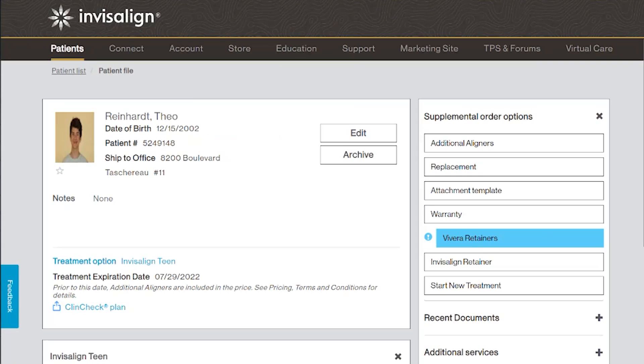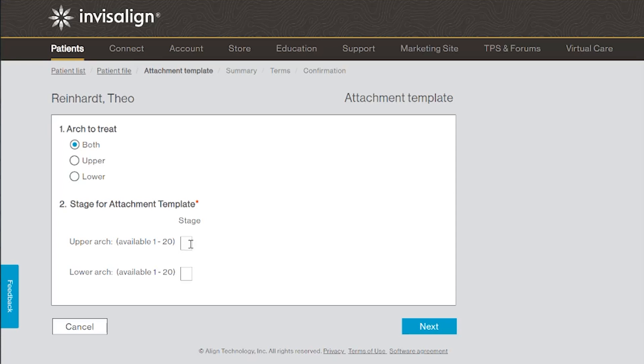That is absolutely the best case if an attachment gets lost — that your patient noticed it at home and calls you telling you which aligner number they're wearing. Then you just go on your doctor's site, click on 'new attachment template,' enter the aligner number, and you receive a perfectly fitting attachment template. It takes about a week to receive, but it doesn't cost you anything.